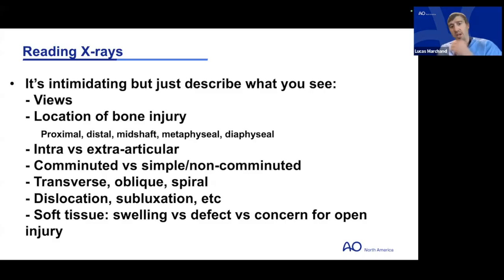That was great. Thank you both. I think another thing you can see, and again, just giving ourselves a little plug for future lectures, is certainly in the pelvis, the presence of a pelvic binder, which may clue you into what EMS was worried about when they brought the patient in, or perhaps the emergency department. So as Dr. Stephenson said, I believe that this is a great framework to work through. It flows very nicely, at least in my mind, as a good way to describe a skeletal injury.